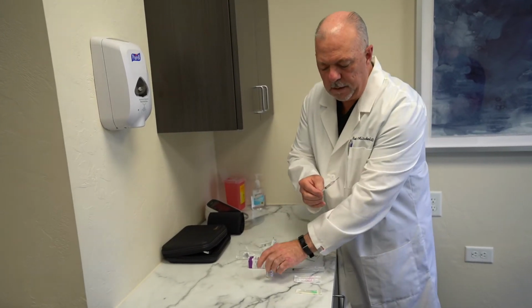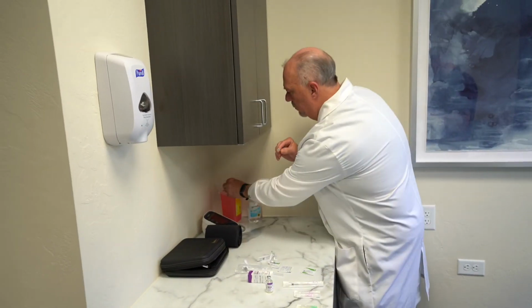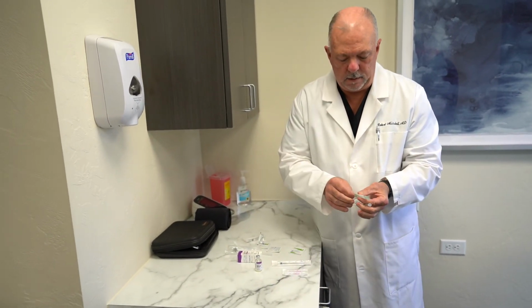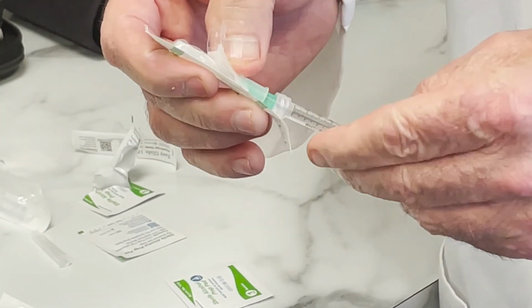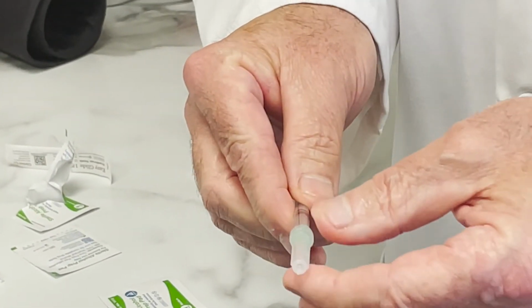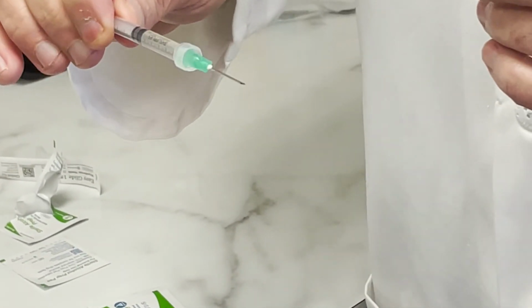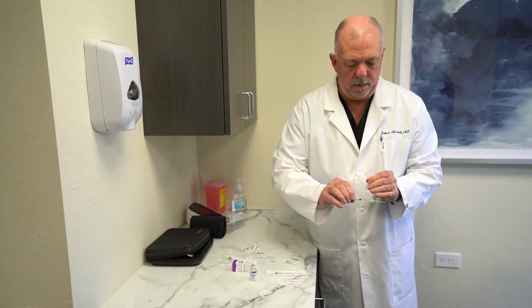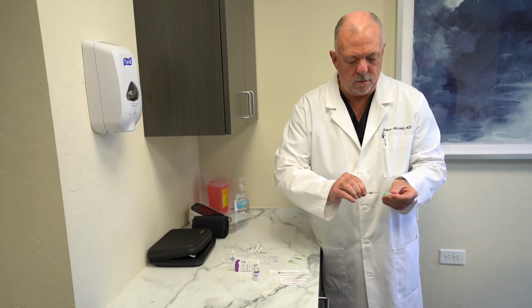Remove the vial of testosterone. We can remove this needle now. And for today's intramuscular injection, we're going to be placing the actual needle that we use for intramuscular injection. For those of you that have used subcutaneous and intramuscular, this needle for intramuscular is about the same size essentially, but it's going to be a little bit longer to get into the intramuscular tissue. And so again, we've loaded a 0.5 mil testosterone dose, now suitable and ready for an intramuscular injection.